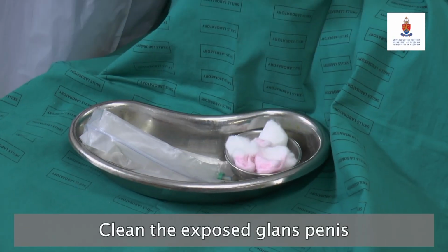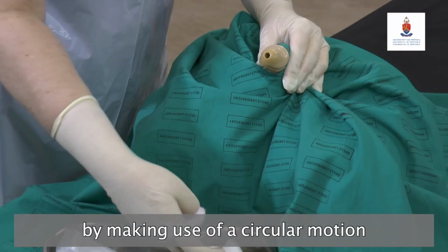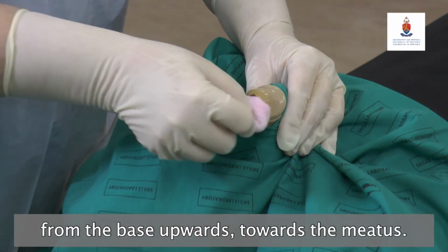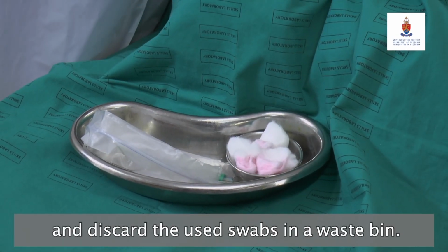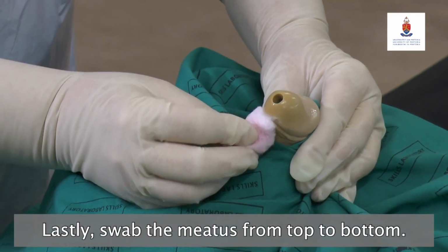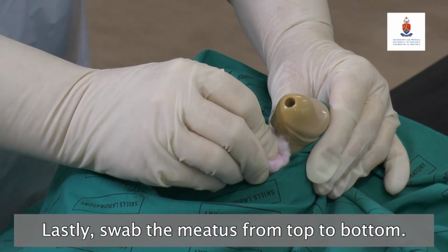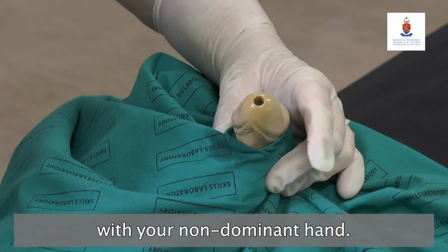Clean the exposed glans penis with your dominant hand by making use of a circular motion from the base upwards towards the meatus. Use a clean swab each time and discard the used swabs in a waste bin. Lastly, swab the meatus from top to bottom. Hold the penis taut and perpendicular to the plane of body with your non-dominant hand.